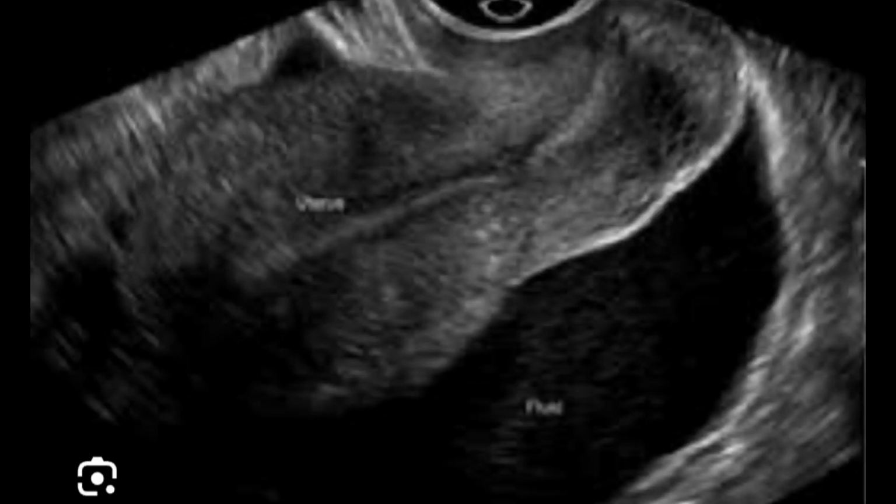In case of any rupture of a cyst, previously a cyst, if this fluid accumulates within the cul-de-sac, this will also be looked at, whether this is because of the rupture or this is truly pelvic inflammatory disease. So these two pieces of information should be taken from the patient and previous record. If both of these are excluded and there is nothing physiological or pathological, then the third point is you may consider that as pelvic inflammatory disease.